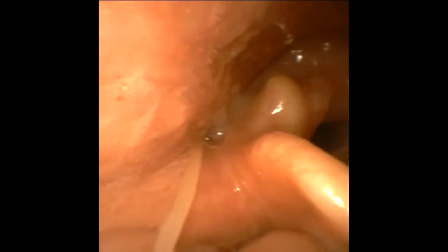Now observe how visible the bone becomes on protrusion of the tongue. We've sprayed this patient up with lots of local anaesthetic to make the procedure as numb as possible.